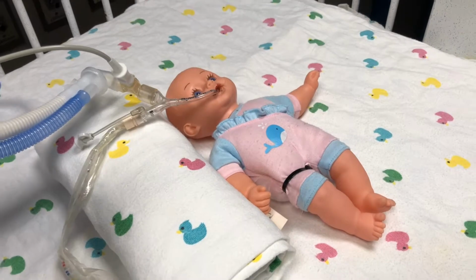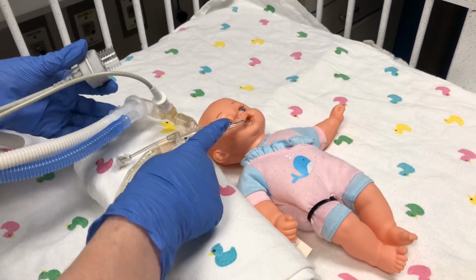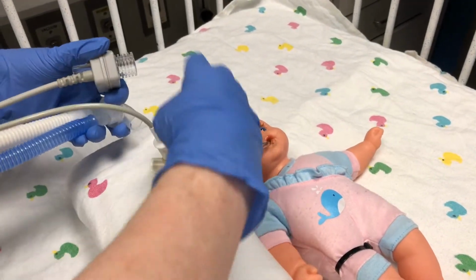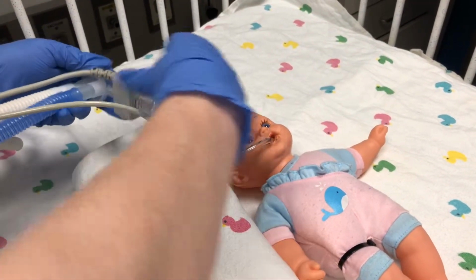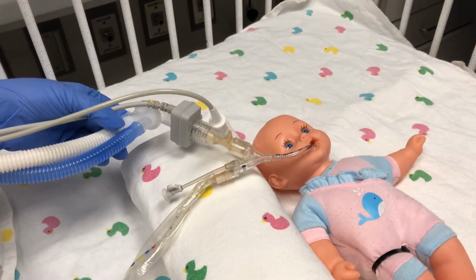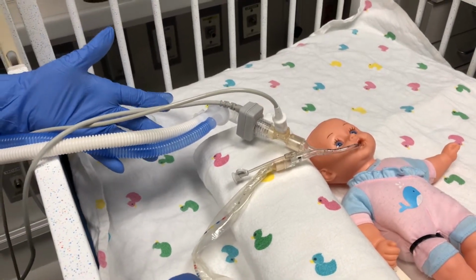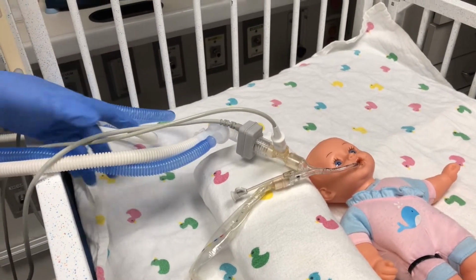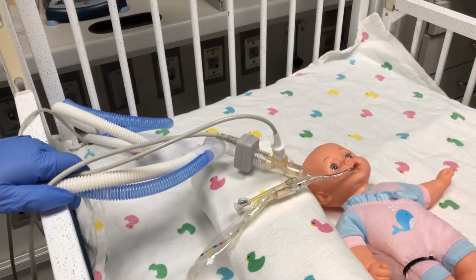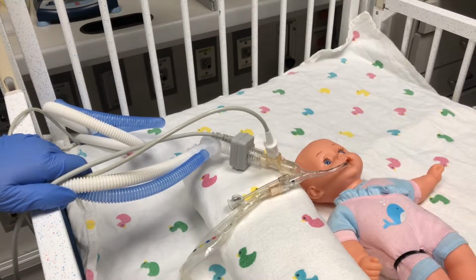So once you've done the initial setup, you need to put the sensor in line. So the order should always be ET tube, flow sensor, then your CO2 adapter, and then your vent circuit. When you do this, you always need to talk to your nurse to make sure she's aware of the extra weight on the circuit, to make sure that all of the circuit stays appropriately supported, since there is going to be more weight than we normally have on our tubing.